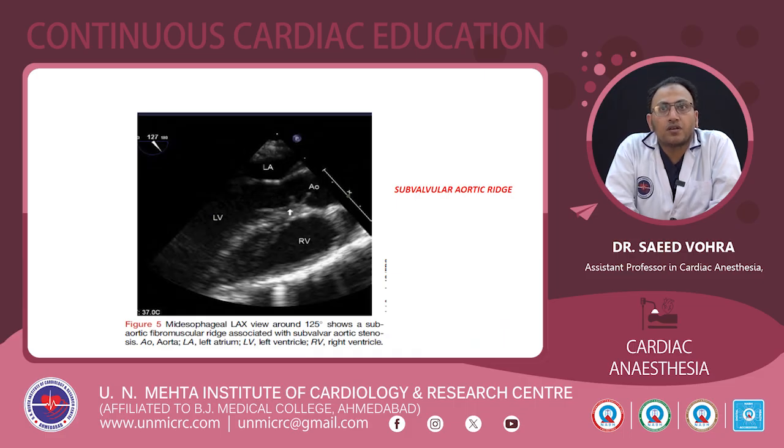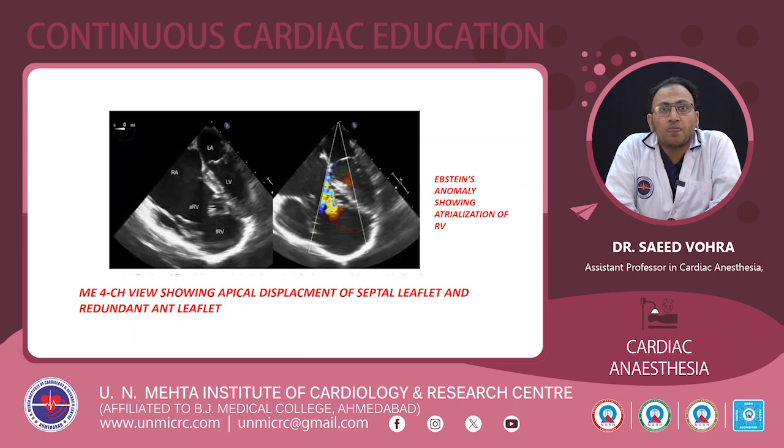Subvalvular aortic ridge can be seen in the mid-esophageal long axis view at 120 degrees. There is a ridge just below the aortic valve, causing subvalvular aortic stenosis. Then there is a patient with Ebstein anomaly, shown in the mid-esophageal four-chamber view, showing the displacement of the septal leaflet, causing atrialization of the right ventricle, and a redundant anterior leaflet.